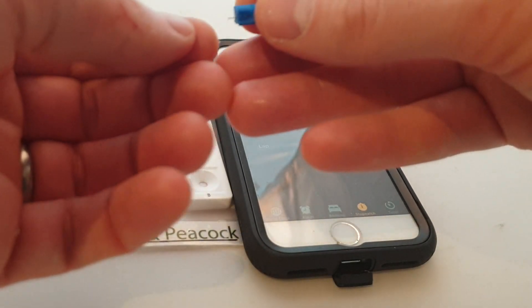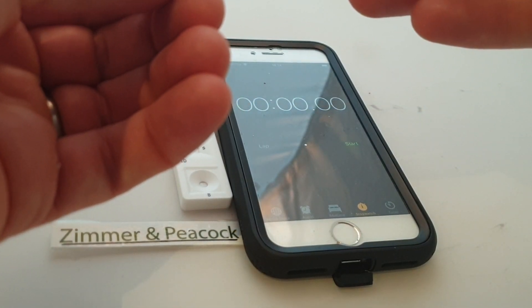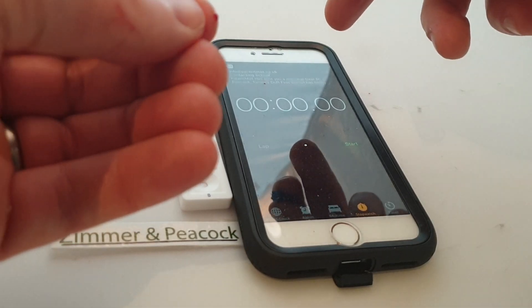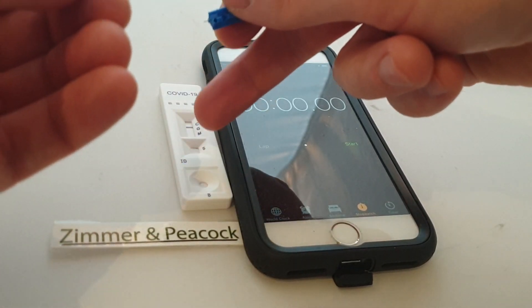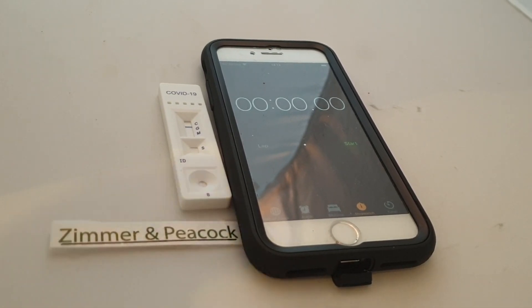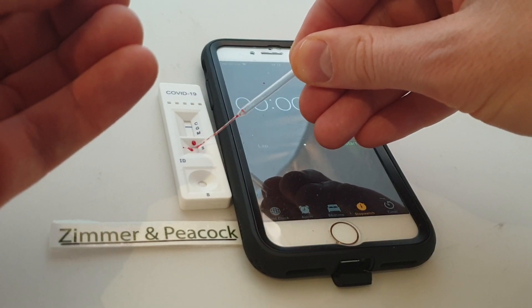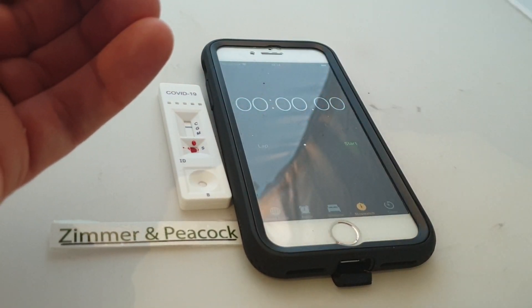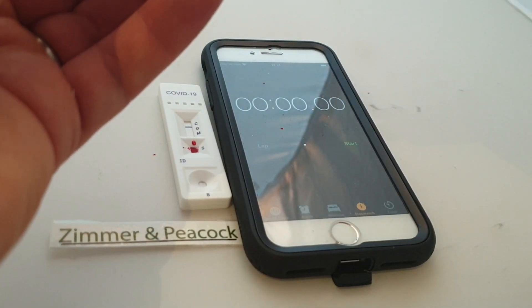What I'll do then is I will take the needle that comes with it and just prick my finger. So I'm sort of massaging the blood out a little bit here. There's a window on the device called S — the S means sample. There's a pipette that comes with the system, so I'm going to try and get that window filled with blood — might put a bit more on.